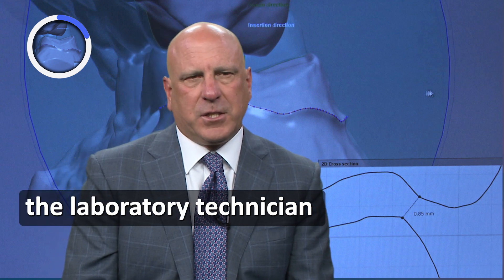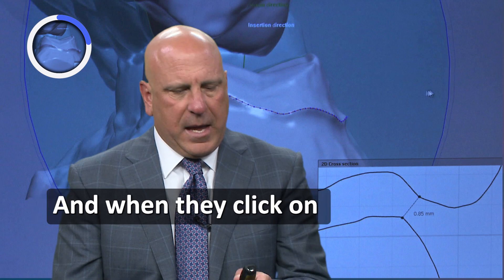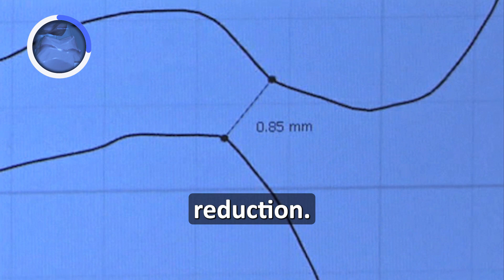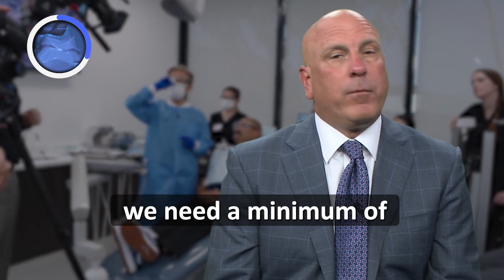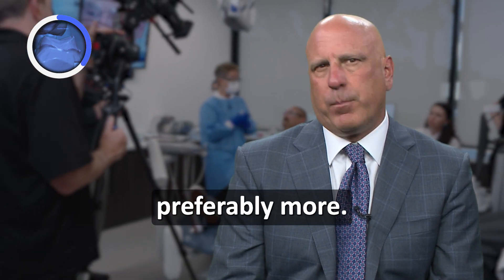The laboratory technician can simply click on the prep tooth and the opposing tooth. When they click on these two spots, it tells them there's 0.85 millimeters of reduction. As you'll see in a minute, we need a minimum of one millimeter of reduction for Emax lithium disilicate on a molar, and preferably more.